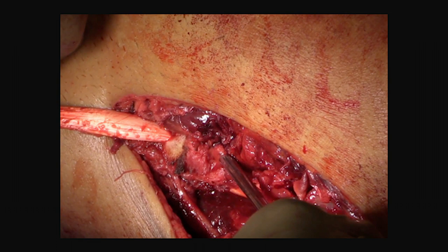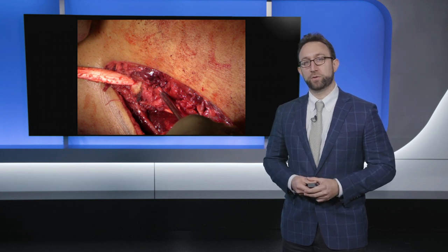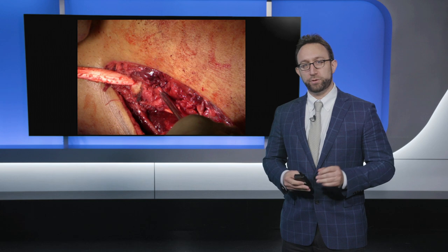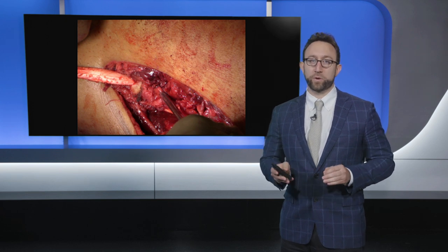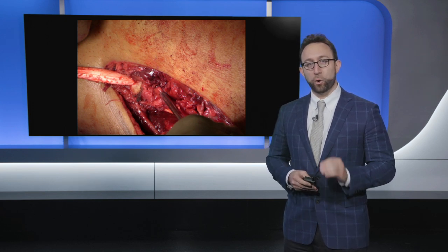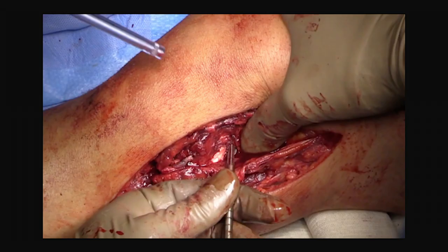Distally, the tibialis allograft has been passed through the fibular head. On the right, you can see placement of two 3.0mm suture tack anchors into the fibular head. This repair is not exactly anatomic — placing anchors in the anatomic location risks the tunnel — so we place the screws slightly proximal and suture them into the biceps tendon just proximal, which drapes the distal biceps over the more anatomic location on the fibular head. Finally, you see placement of our interference screw into the lateral epicondylar tunnel for the LCL portion of the tibialis anterior allograft.